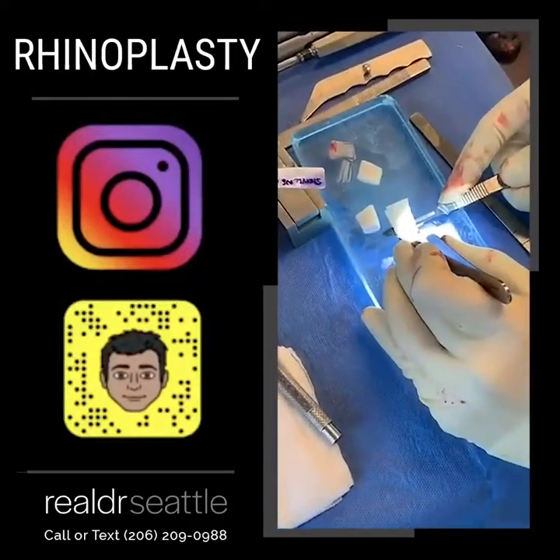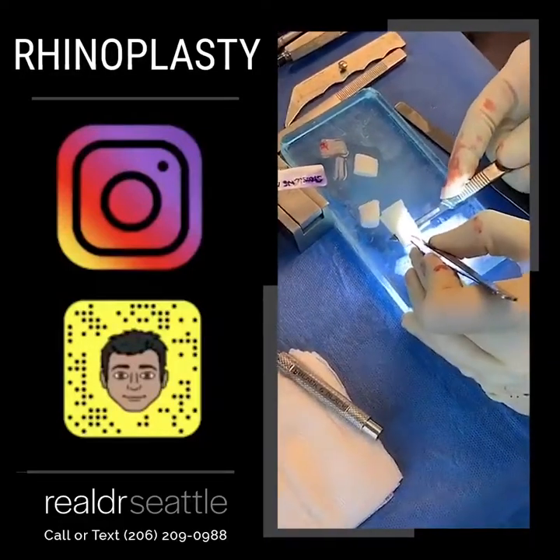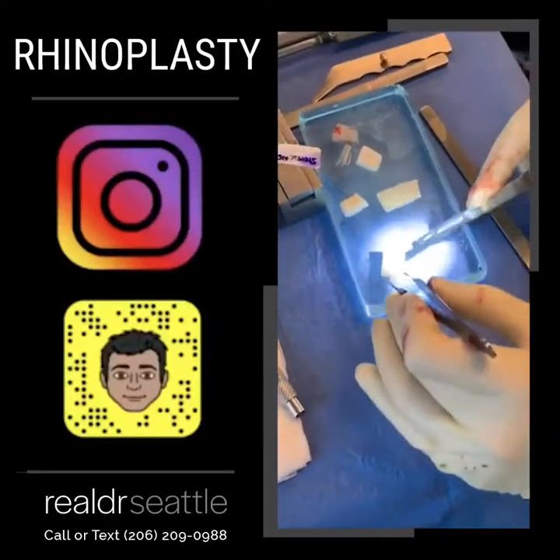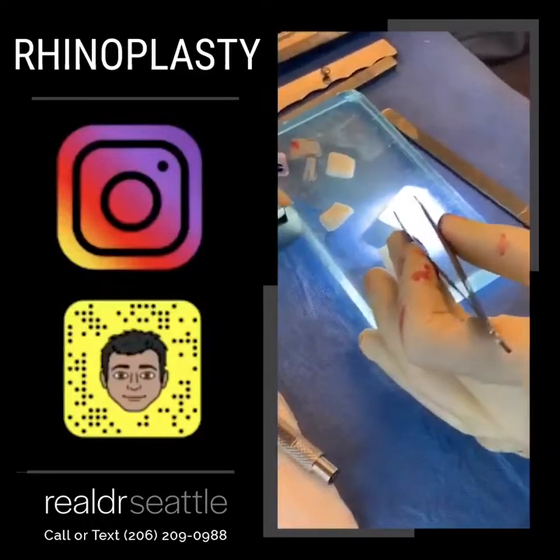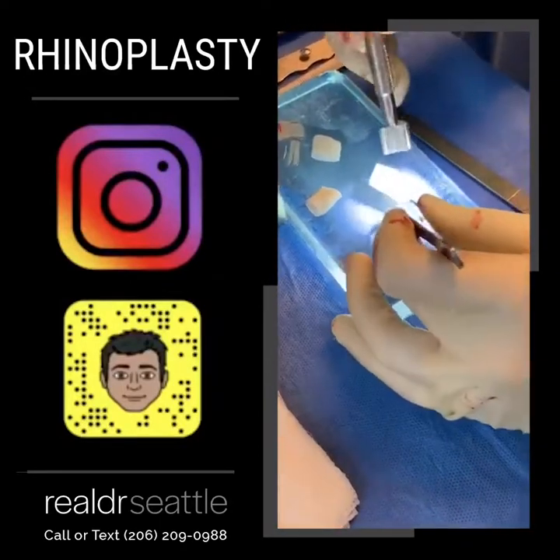We are sculpting our cartilage to make our graft. I'm using some rib cartilage here to make the graft for the nose. I've made it thinner because it was too thick, and now we're going to cut it to this nice straight piece. We're going to use a template to help make the graft perfect.